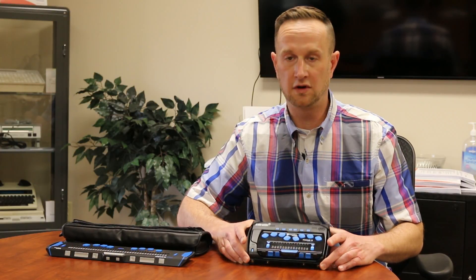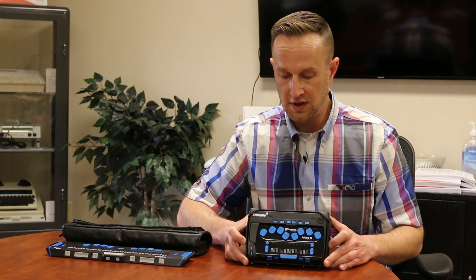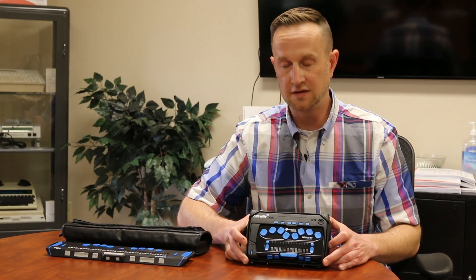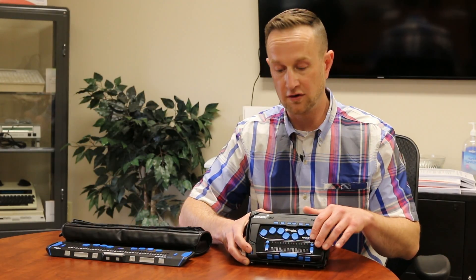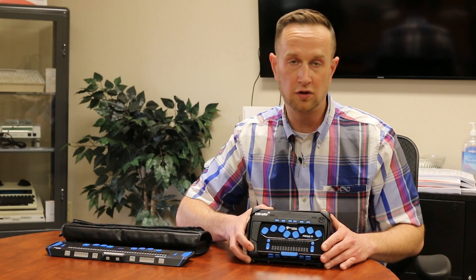So the user on the go has all of the basic applications they would have with their normal PC — from texting to emailing to surfing the web, any type of computer application you may need. What's nice about the Focus 14 of course is the size of it. It's very small — a 14-cell Braille display — very small and portable.